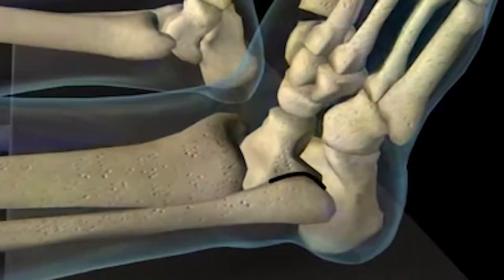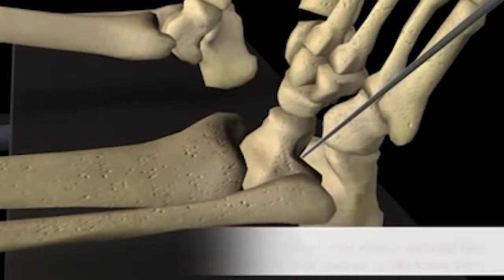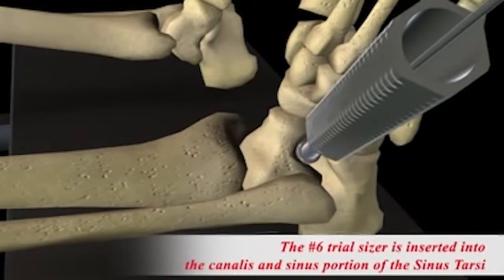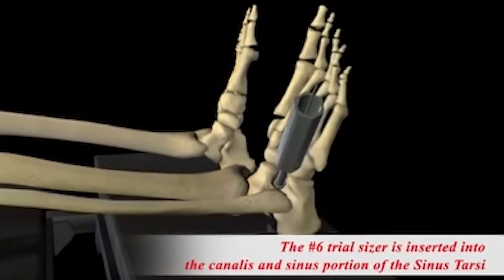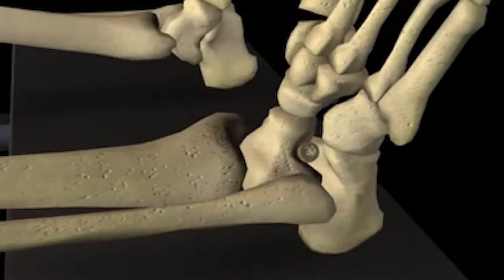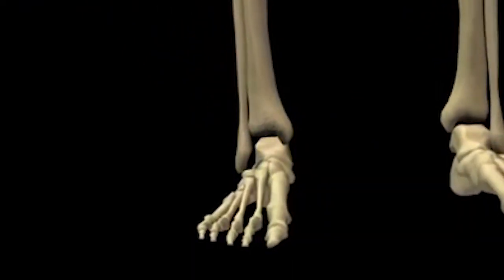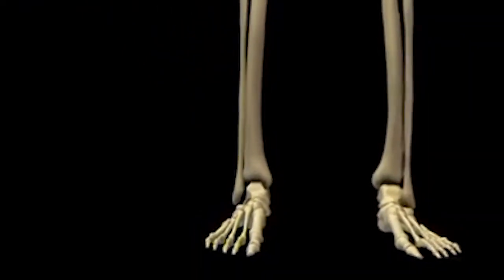The procedure is performed through a small incision under local anesthetic and or twilight sedation. Instantly following the insertion of the HyperCure stent, the ankle bone is realigned and stabilized. Most patients are walking immediately in a special shoe and are back to normal walking within a few weeks. The tendons and ligaments within the foot and body will adapt to their new position over the next several months.